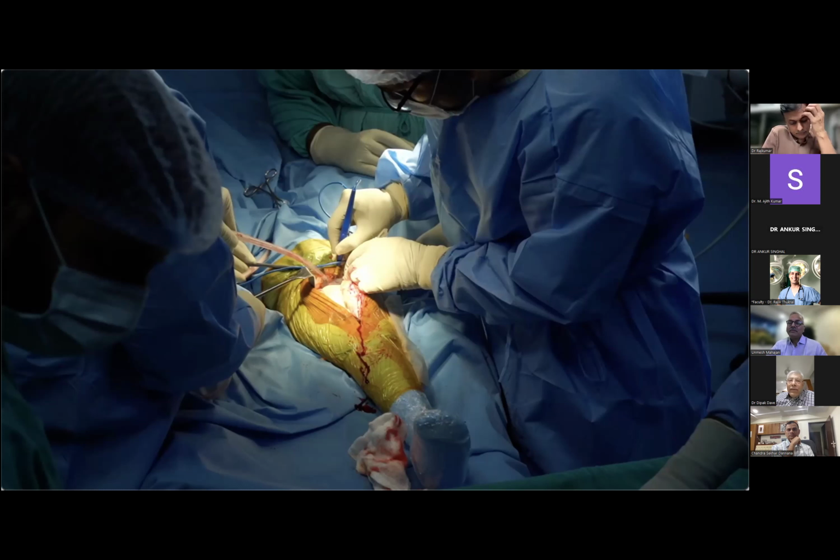They use a new femur. Again, it is considered not as a one-stage revision. It is known as a 1.5 stage revision. So people have been using it. In our country, probably using the autoclavable femur should not be any problem. But in Europe, it is not allowed to do that. Maybe the surgeon is lucky. The patient may not even come for a second revision after all these things. That is the whole idea for the 1.5.